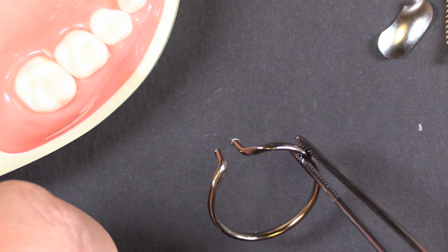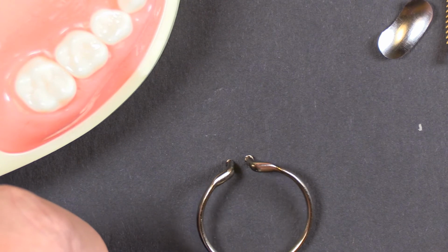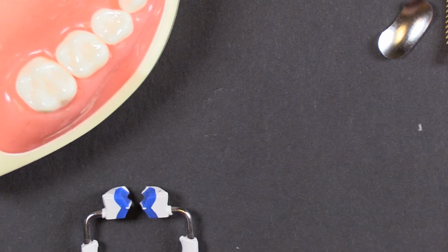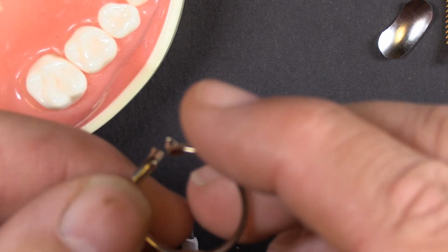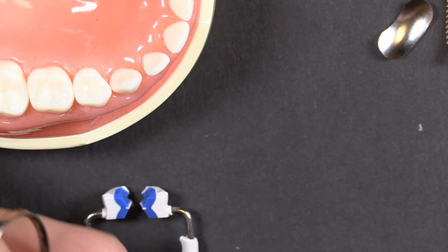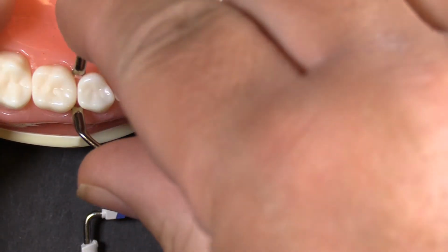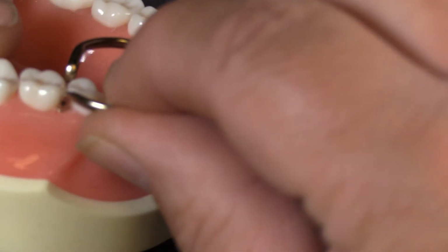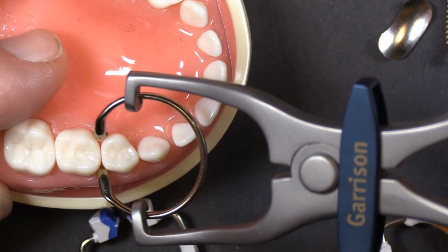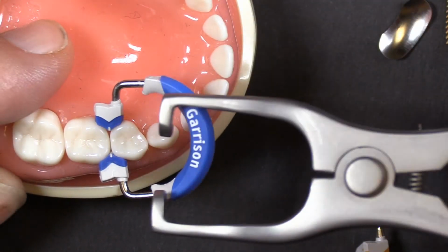And then there's nothing wrong with having a few of these in your toolbox as well. I know several pedodontists who truly preferred the old gold rings because of how well they gripped on those little teeth. Placement of these is identical to any placement, but because of the aggressive tips that they have, the burnish on the tips, they do a good job of grabbing on to the tooth. And you can do that with the blue ring as well.